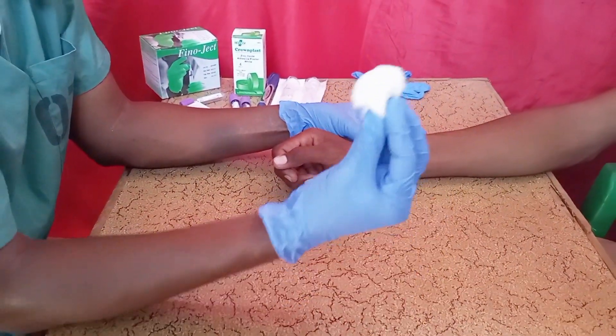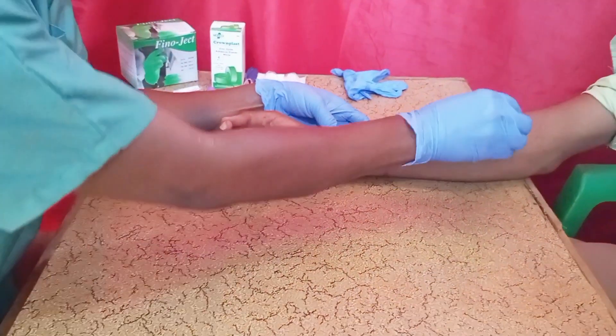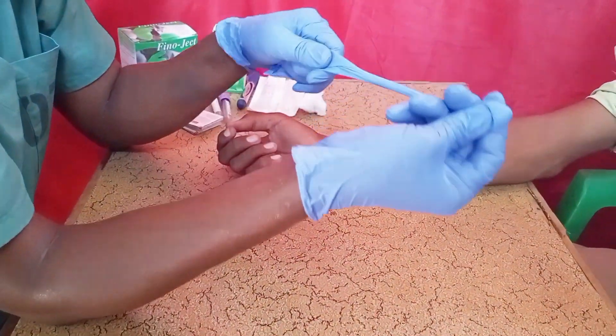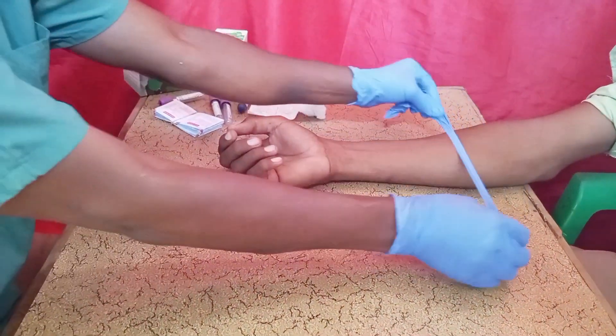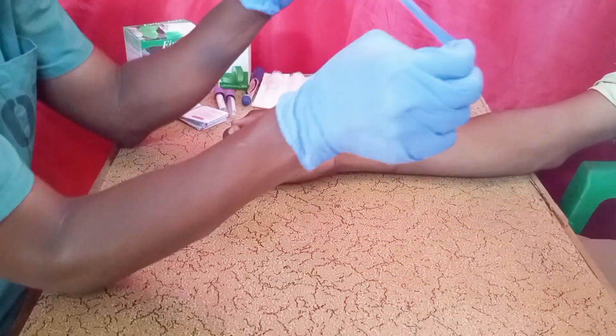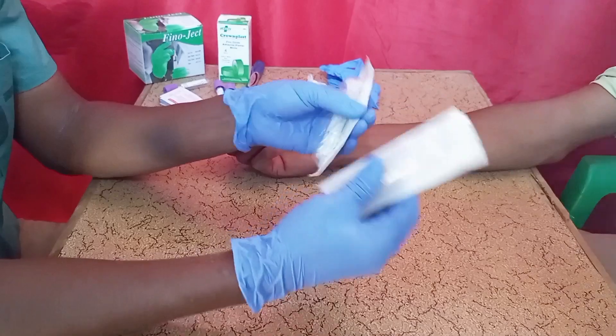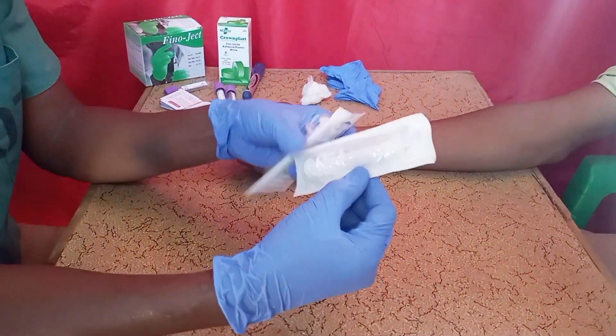You may also need cotton wool to apply pressure on the area where you have given the shot. You may need a disposable glove to use as a tourniquet. And of course, you will need a syringe to withdraw the blood.